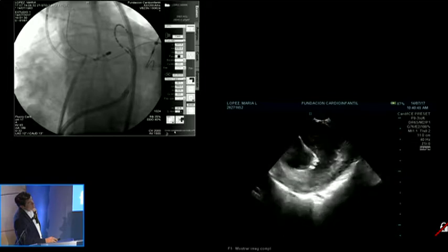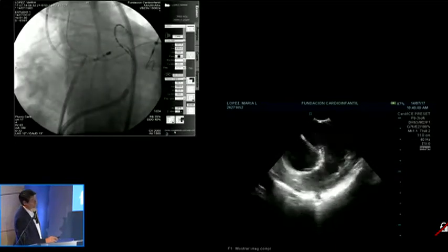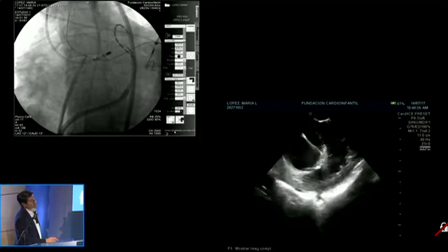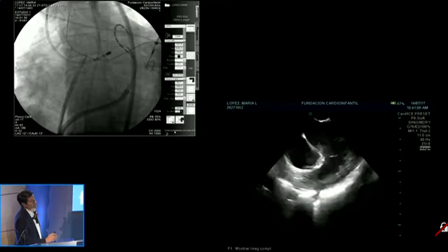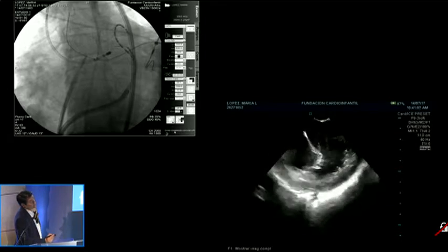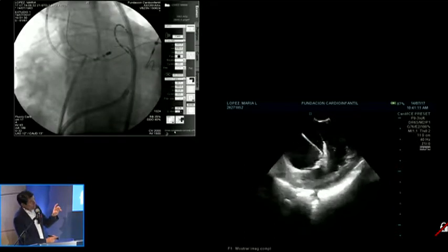Maybe we can connect the computer so I can explain to you where the localization is. I can show it in a second on my computer. That would be another discussion point, but let's get ready for the next step, either to place the ablation catheter or go into the veins.